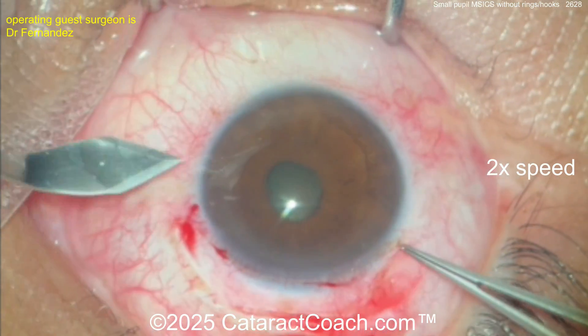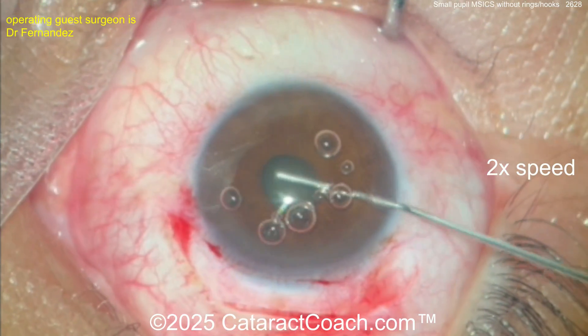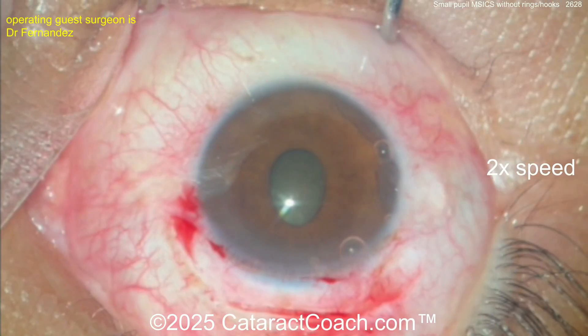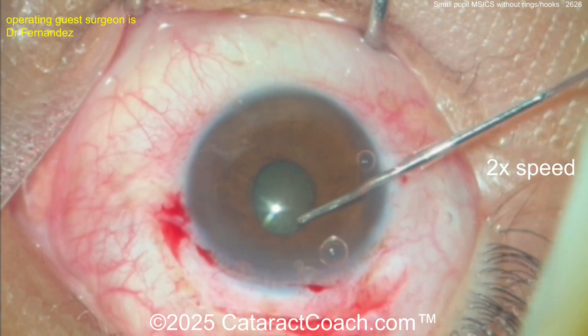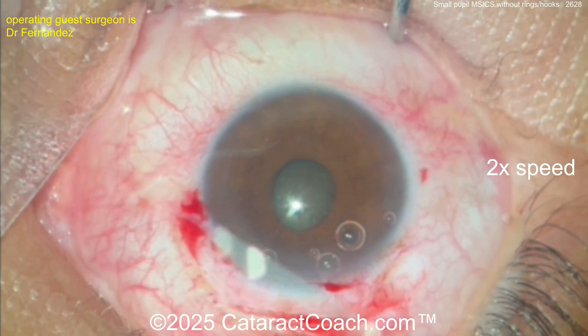Here's a side port incision, probably going to be used for a Simcoe cannula later, and here's another one on the other side for manual irrigation-aspiration. You can see it's definitely a small pupil. Now you can put in some hooks and stretch out the pupil if you'd like, or put in a ring, but this surgeon is going to do without. Breaking any synechiae there, and once the synechiae are broken, you want to do a little bit of pupil stretching to get better exposure.